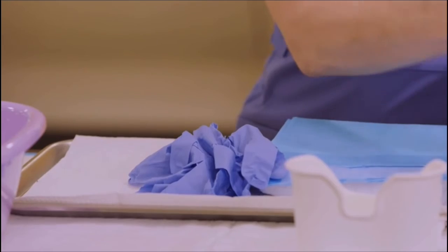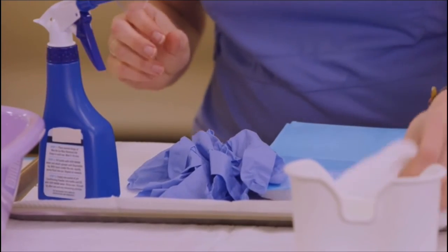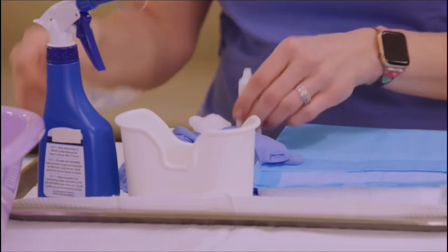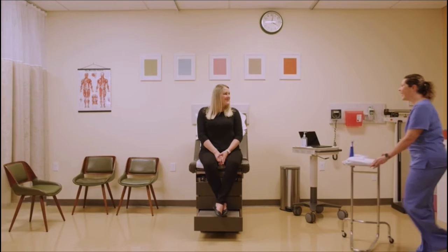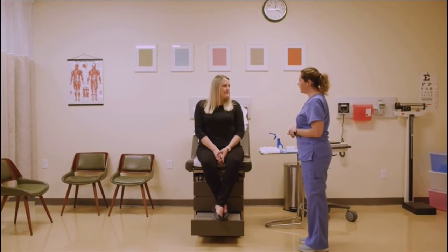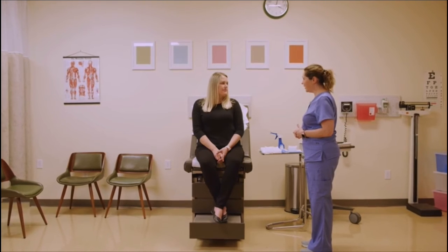Place waterproof drape, multiple gauze pads, an ear basin, a couple of cotton balls, and ear wash spray bottle filled with warmed solution on a tray to transport to the exam room. Greet the patient, identify yourself, and state your name and title along with the provider you work with. Confirm patient identification using 2 identifiers.